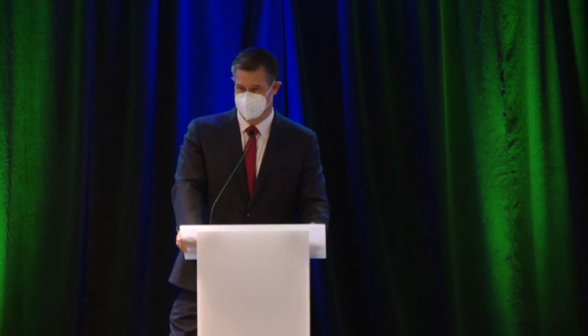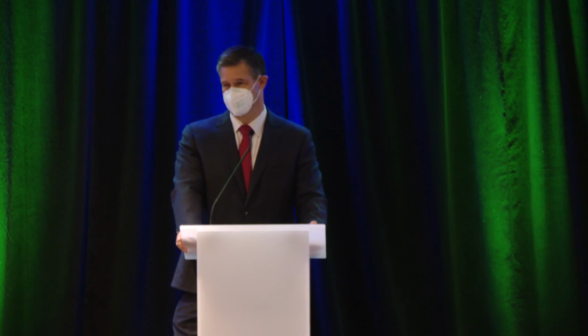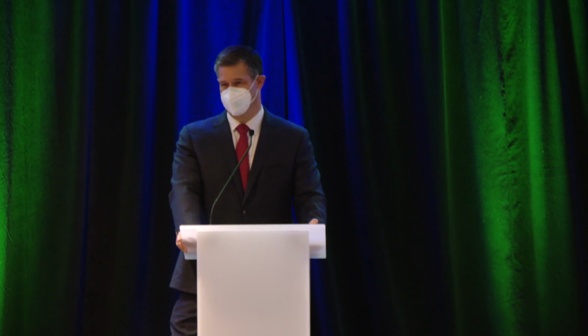Hi, good morning. This is Salah Sama from Kansas. Two brief questions about IRP and two examples. If you have a large hiatal hernia, where the catheter passes the LES but is stuck in the hernia sac, can you put your gastric marker in the hernia sac, or does it have to be below the diaphragm?